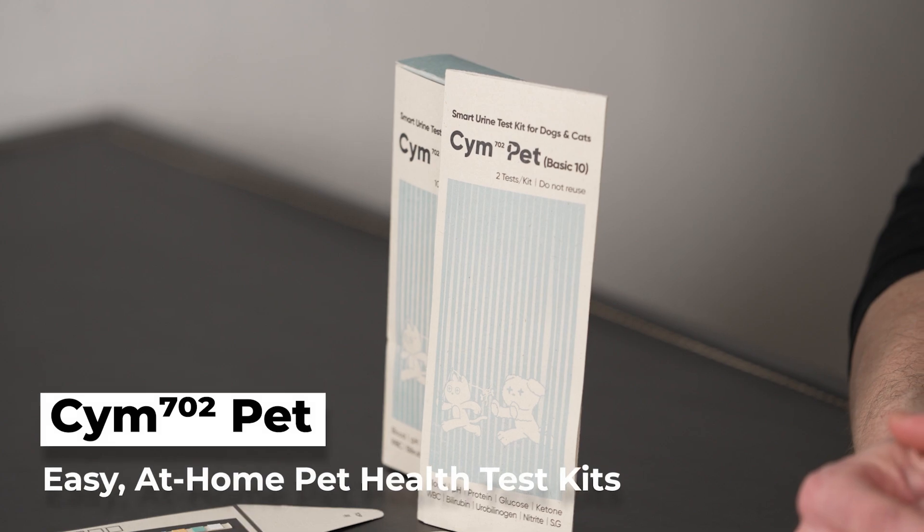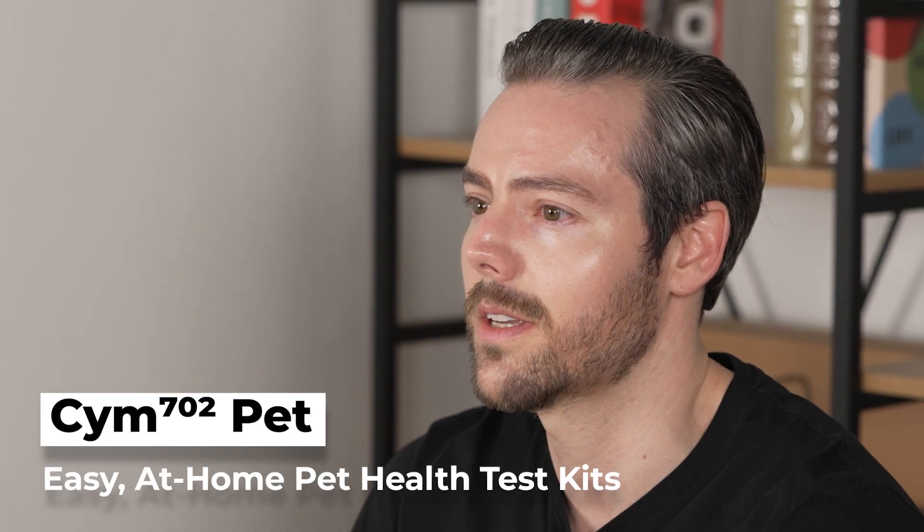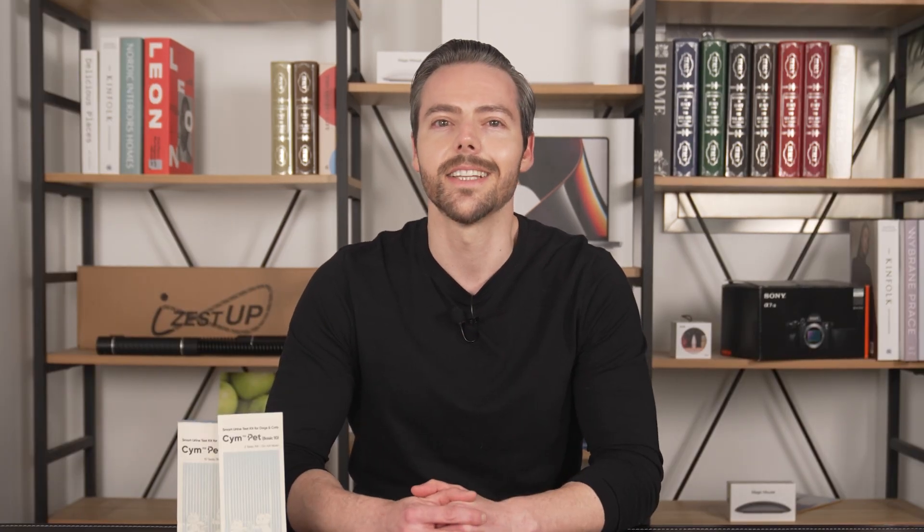Hey everyone, welcome back. This is Cool Gadgets and I'm Scott, and today we'll be taking a sneak peek at the Cym702 Pet Test Kit that'll be launching their crowdfunding campaign later this month. We're about to see if this test kit passes with flying colors or if it needs to spend a little extra time in class. Let's get into it.